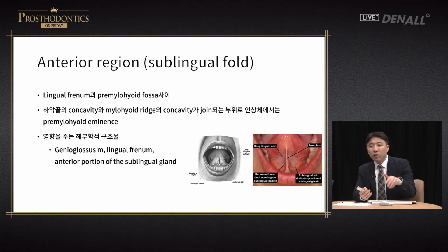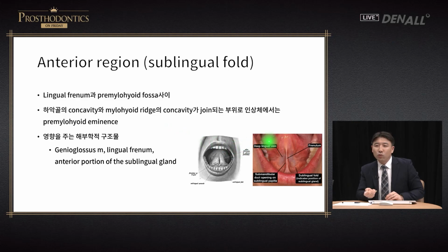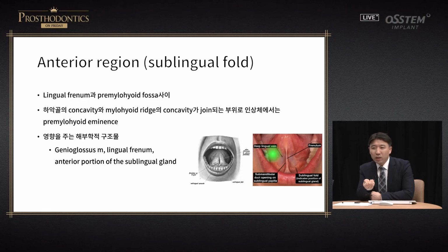Let's look at the lingual side once again. I've talked about how seal gets broken at the frontal part in the lingual side. The patient in general has a habit of retracting tongue. In the anterior side of the lower, on the lingual side, there is a wrinkle called sublingual fold.